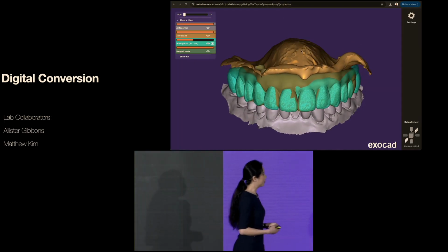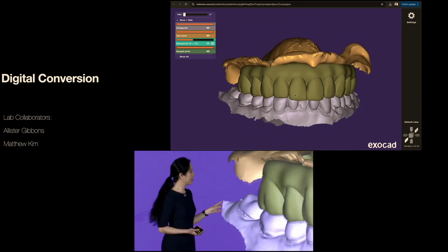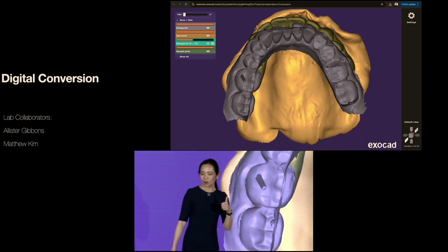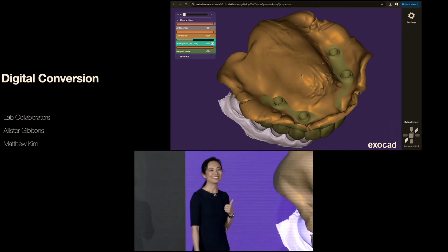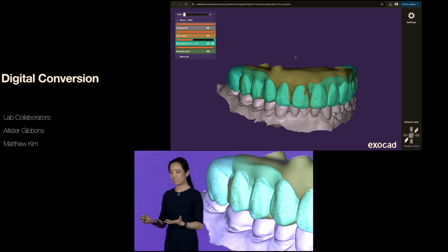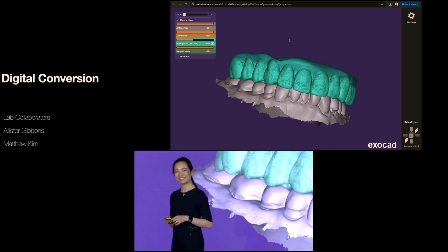And from there, we can actually merge the original denture setup that we made with the new implant positions. And what we did was use the patient's original bite reference in order to create the proper occlusal relationship. And what you're seeing me check for here is 1, what the implant abutment library they used was, because guess what? There can be errors there. Another thing I'm checking for are the prosthetic contours and ensuring that this is going to be hygienic and have a nice, gentle seat. How many of you have experienced putting excess pressure on gingiva on the day of immediate load?